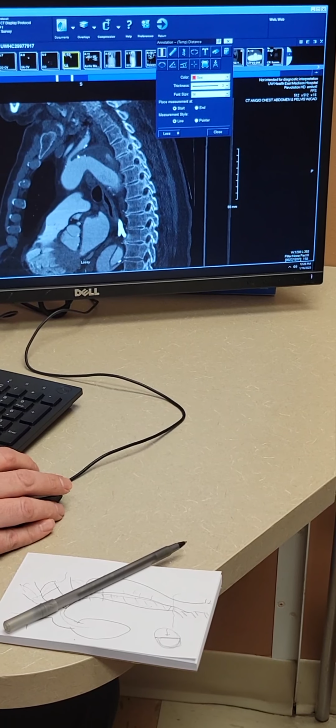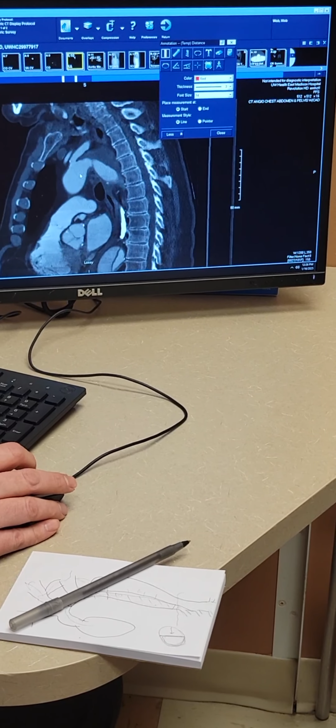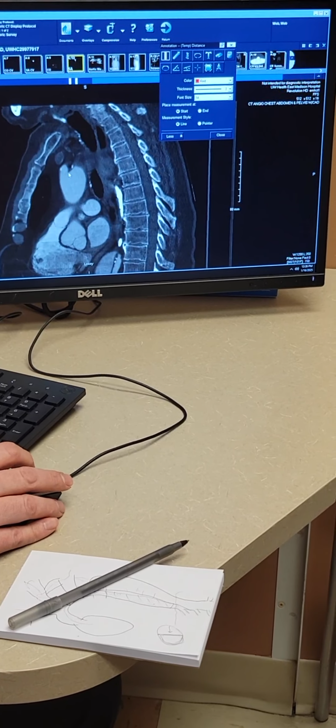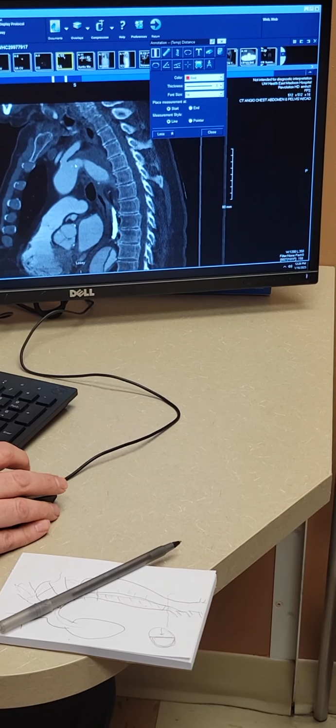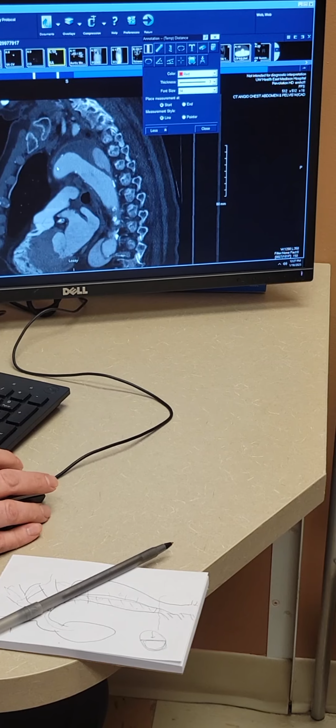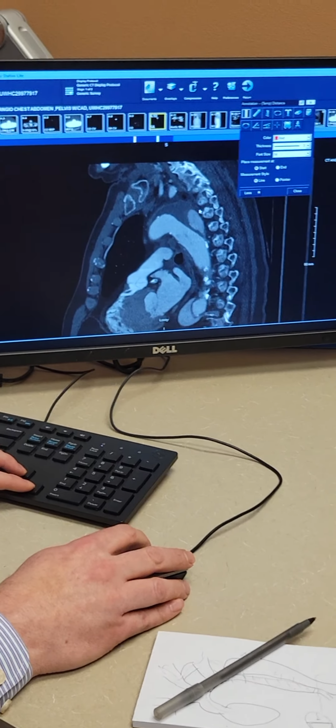So you see how there's kind of this shadow out here? That's the non-normal aorta. And so what I need to do is to bring the stent all the way to right there in order to get enough seal in normal aorta. But here's the dissection. So you can see this is the true lumen. This out here is the false lumen.